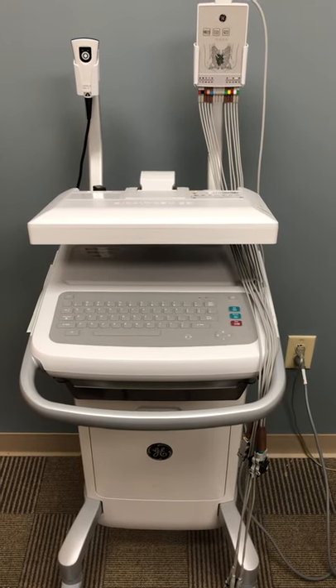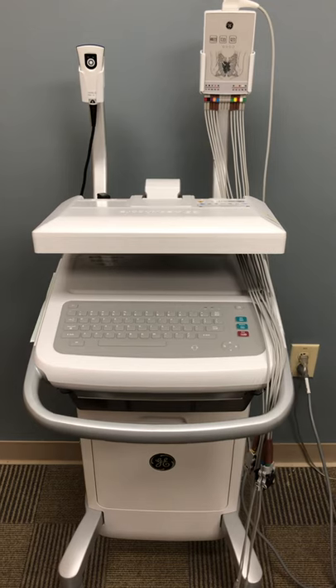This video is going to walk us through the new EKG machines that the Critical Care Service Line is using.